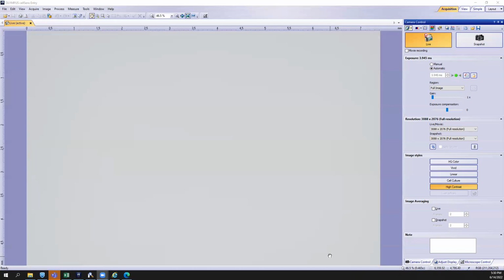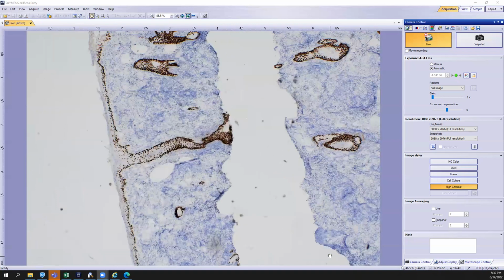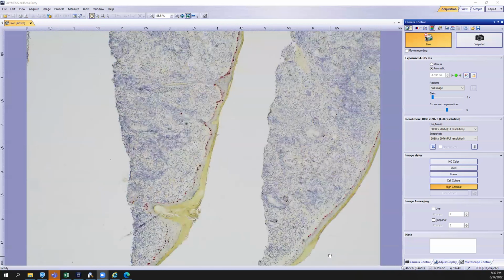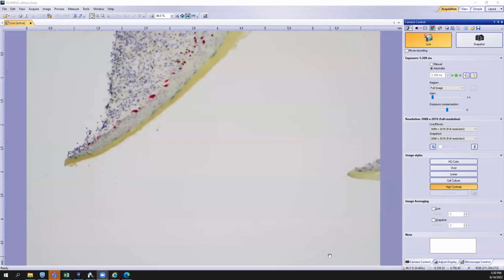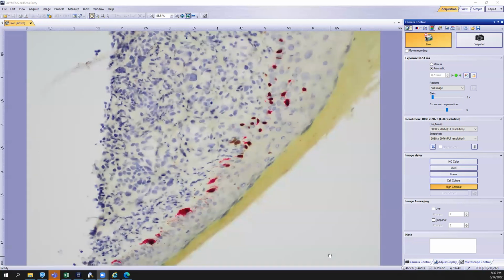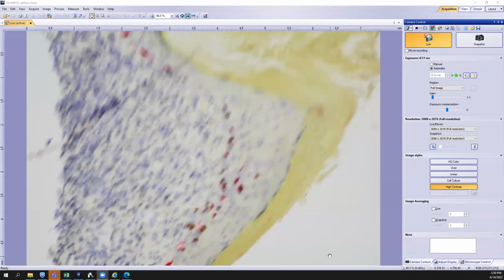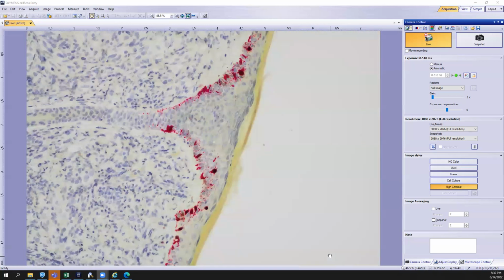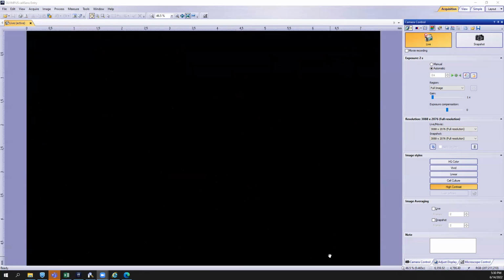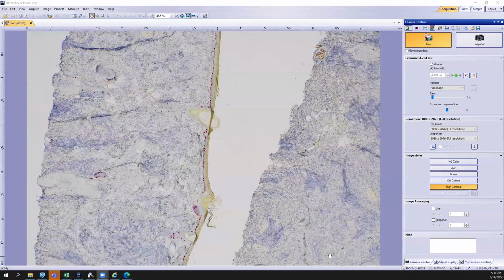And if you look at, let's say, a P40 stain just for squame, another marker of squame, you can see it nicely highlights the epidermis, but negative in the neoplastic cells. And just as kind of a broad initial workup, it's always good to look at melanocytic stains. So you can see here, this is a double stain for melan red and SOX10 brown. And so maybe a little bit of melanocytic hyperplasia in the scalp of somebody who's chronically sun damaged. But negative in the neoplasm itself.